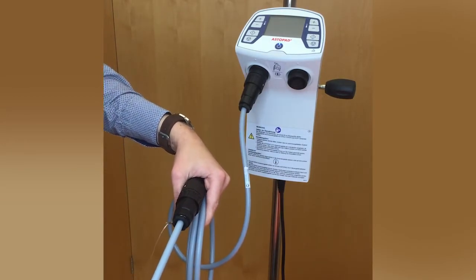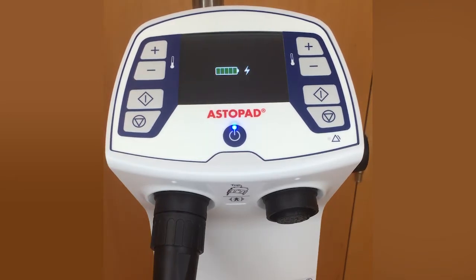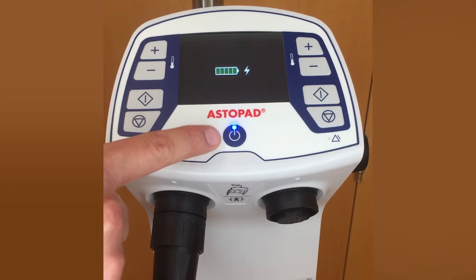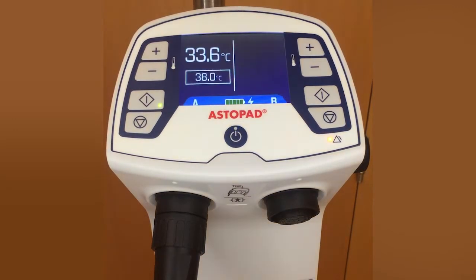The Astopad patient warming system is now ready for use. For a device with a built-in battery, the battery charges in standby mode when the device is connected to the wall, and battery capacity can be seen in the controller display. To turn on the control unit, press the standby button on the display. A self-test runs — all LEDs flash and the acoustic alarm signal sounds — until heat mode is started by pressing the start button.